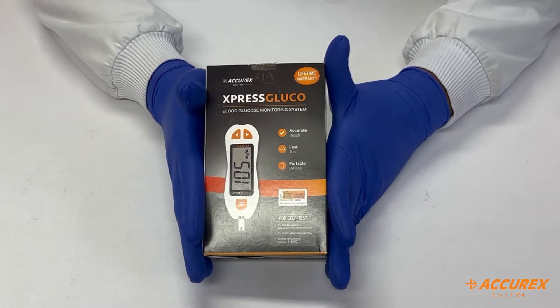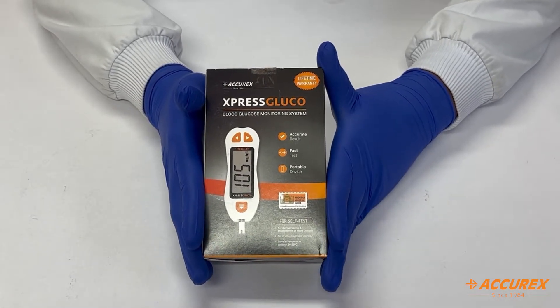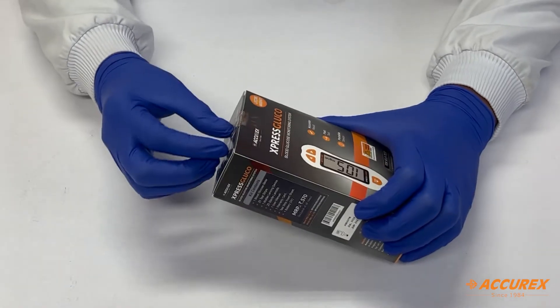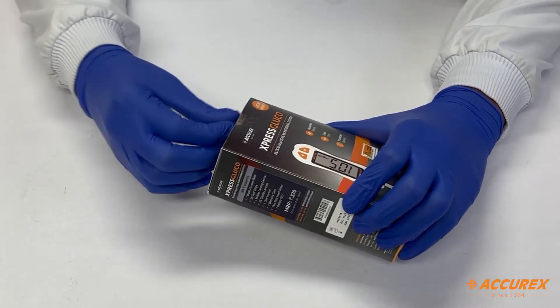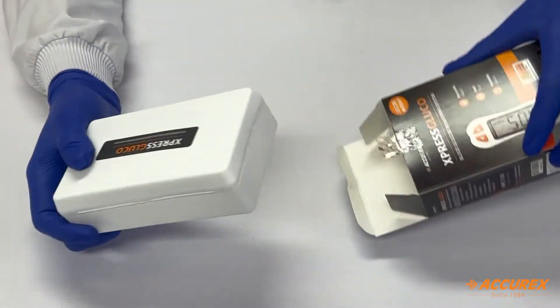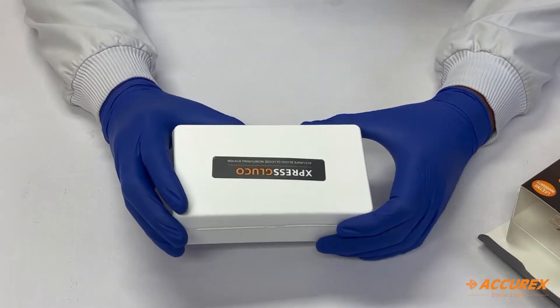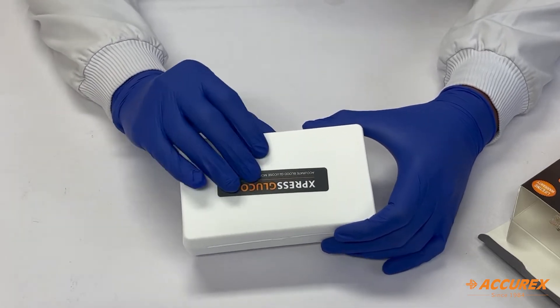Hello everyone, today we are going to see how to operate the Express Gluco blood glucose monitoring system. First, let's do the unboxing. After removing the box, you can see the material used for the kit is of premium quality, so it will protect the content inside.